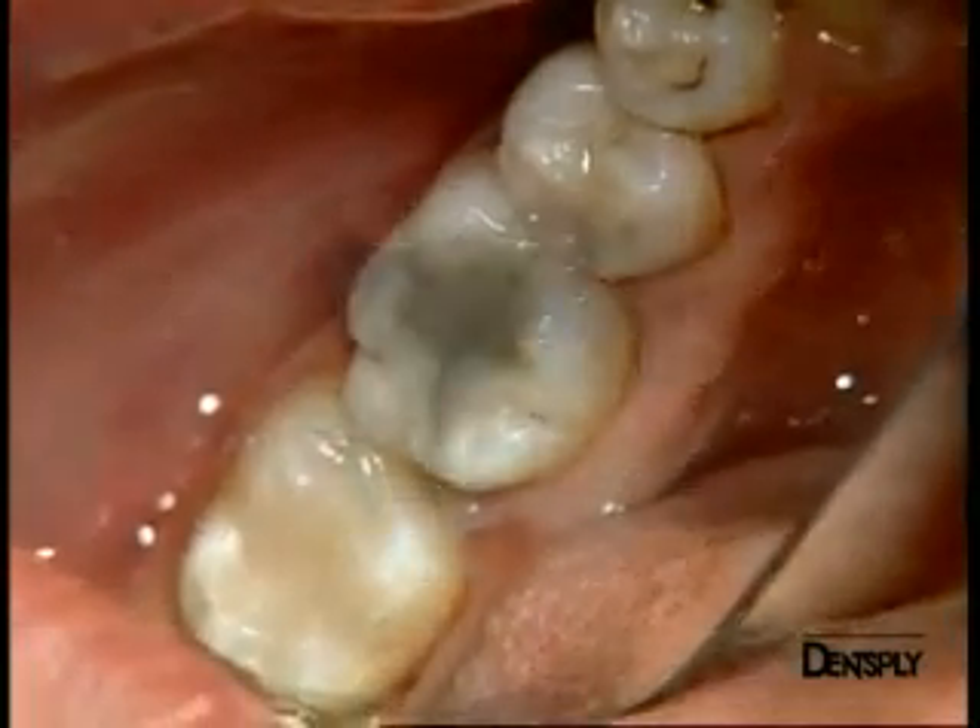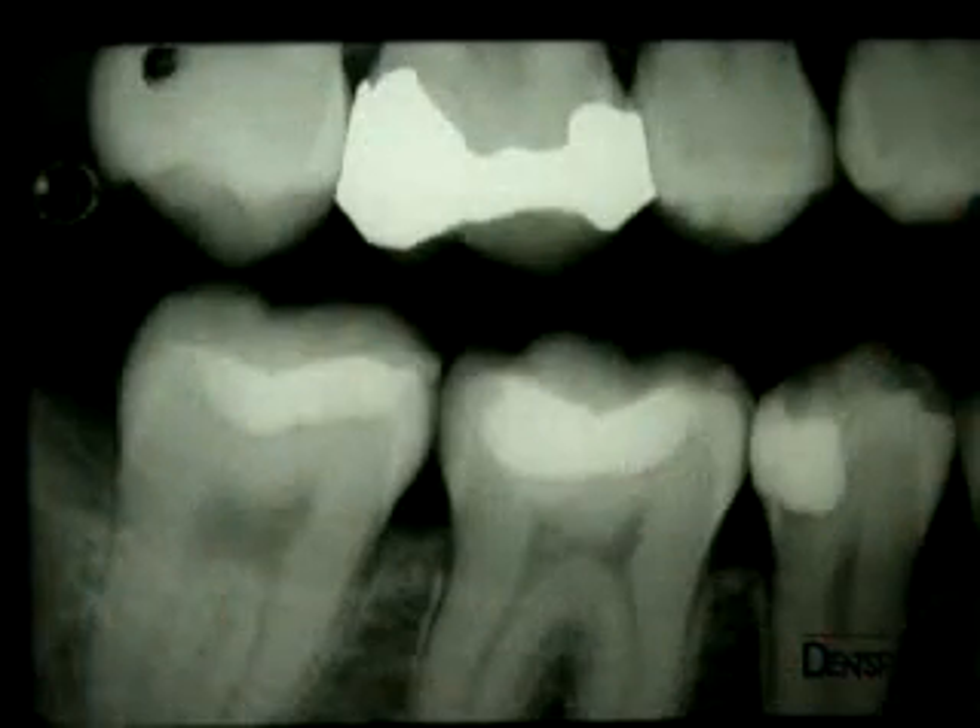Here is a general view of the filling on the post-operative x-ray. You can see the excellent cervical adaptation of the proximal filling on the premolar, and the good radio-opacity of the Quicksville filing.